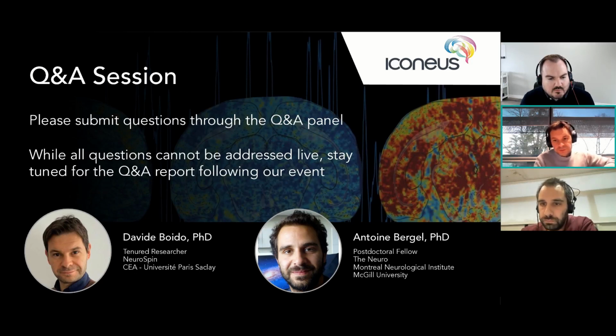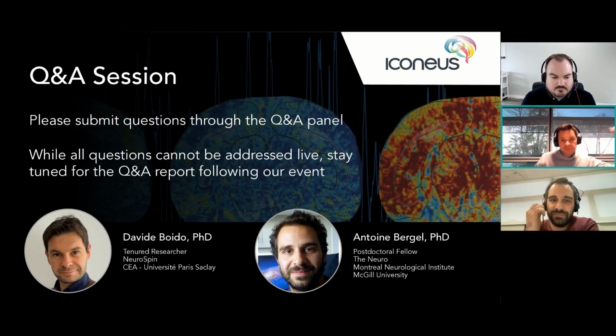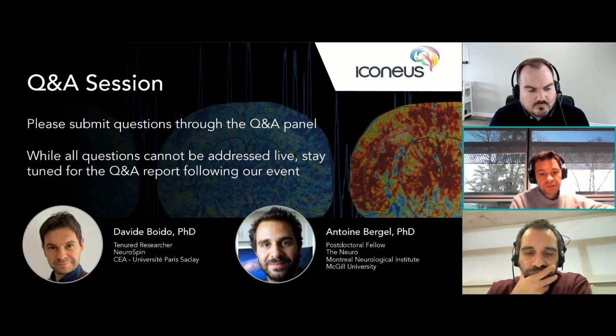Yeah, in fact, that's a good question because there is quite a bad habit, from my point of view, in neuroimaging to consider pretty much the stimulation pattern the same as the neuronal activation pattern. And this can be acceptable in a first approximation if you are dealing with something with a slow temporal resolution. But if you can sample fast, and if you are in a condition in which, as in our case, the neurovascular coupling is fast, as we found, then you can no longer make this assumption.